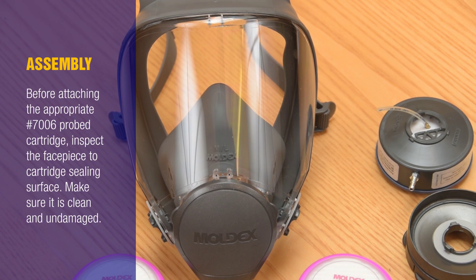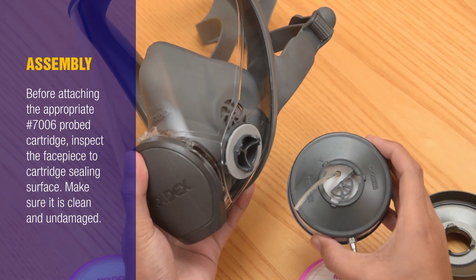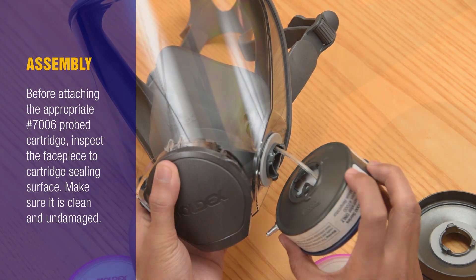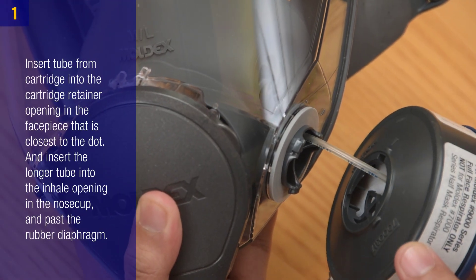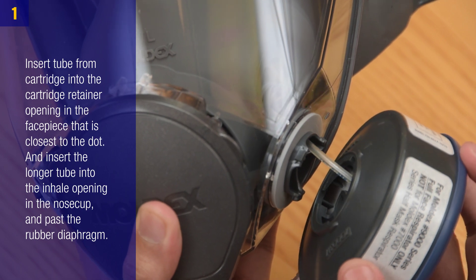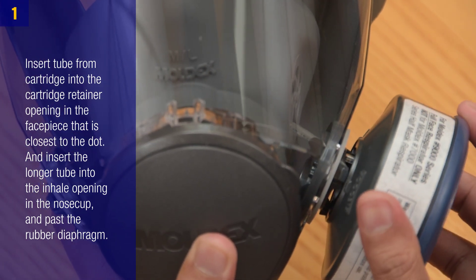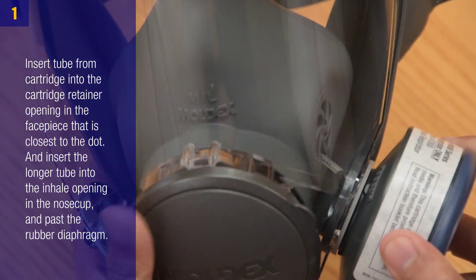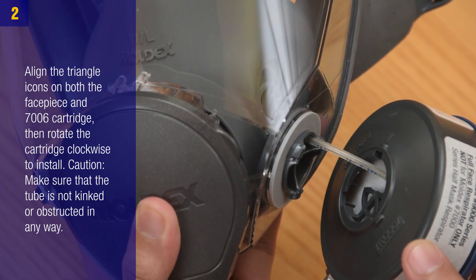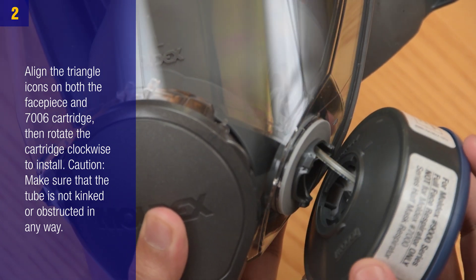Assembly: Before attaching the appropriate 7006 probed cartridge, inspect the face piece cartridge sealing surface and make sure it's clean and undamaged. Step 1: Insert the tube from the cartridge into the cartridge retainer opening in the face piece closest to the dot, and insert the longer tube into the inhalation opening in the nose cup and past the rubber diaphragm.